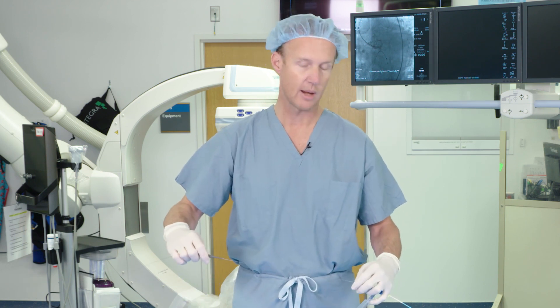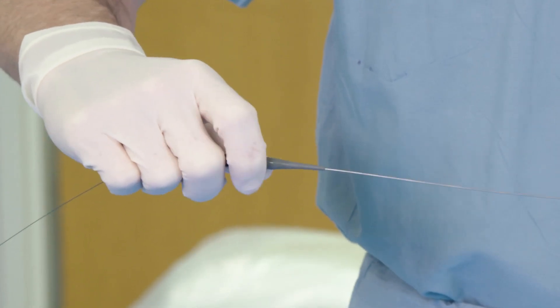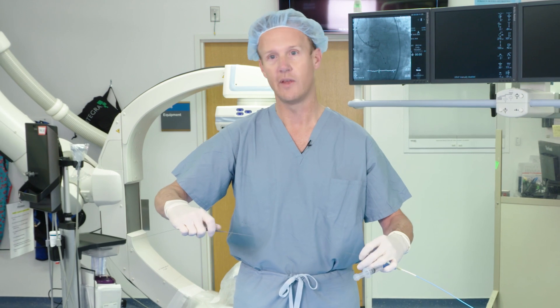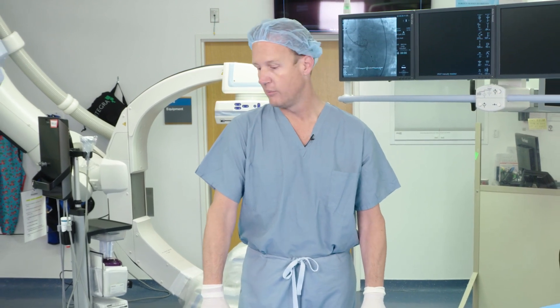I do counter-clock this catheter at times if I'm stalled. If I'm clocking forward and reach a point where I stop seeing progression, I will counter-clock usually five, six, or seven times, see where it goes, and then start clocking again. Oftentimes that will get you through a stall.